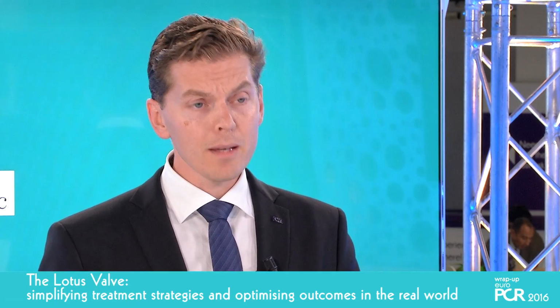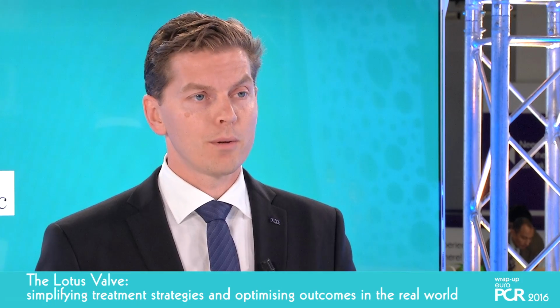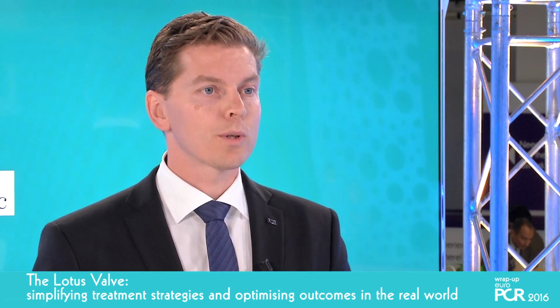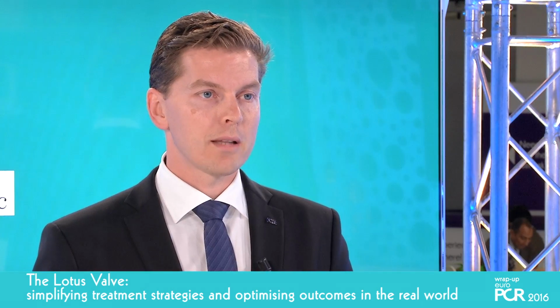And this really mirrors what we saw in our practice. We started off with 18% pacemaker rates in our first 50 patients, but in the last 50 patients, we only have 8% pacemaker rates. And the main difference is that we avoid oversizing. In other words, we try to avoid LVOT overstretch. The other thing is that we try to implant the valve in a more cranial fashion and really try to avoid the AV node altogether.